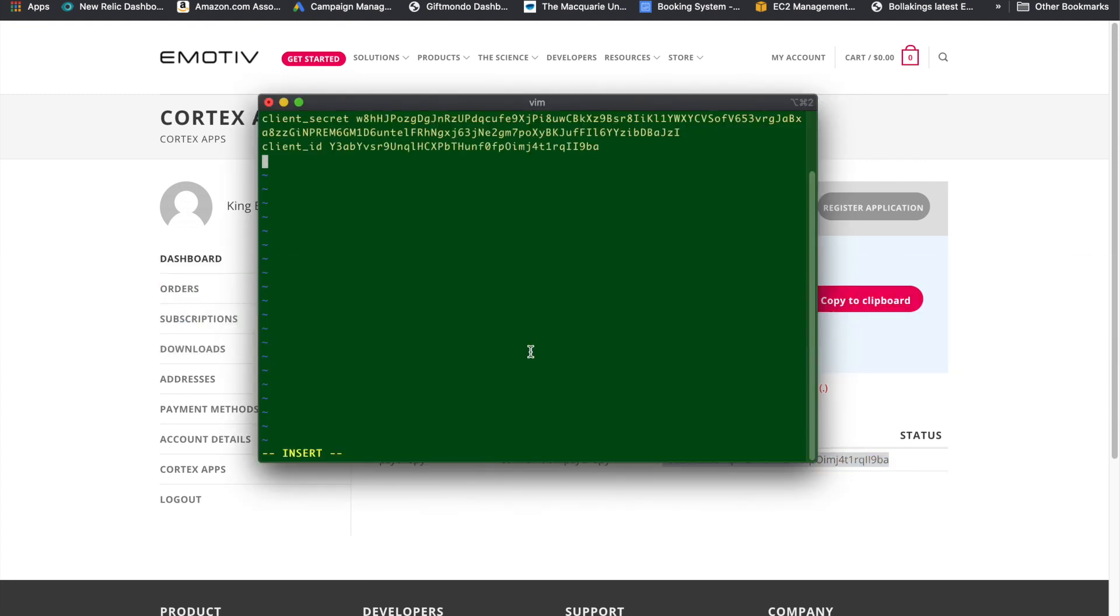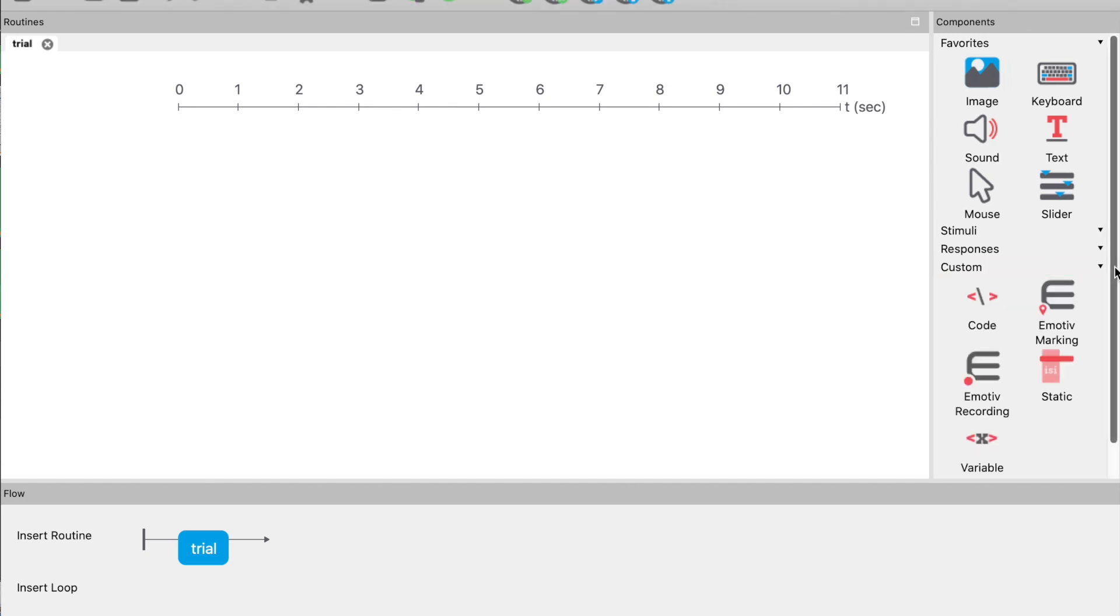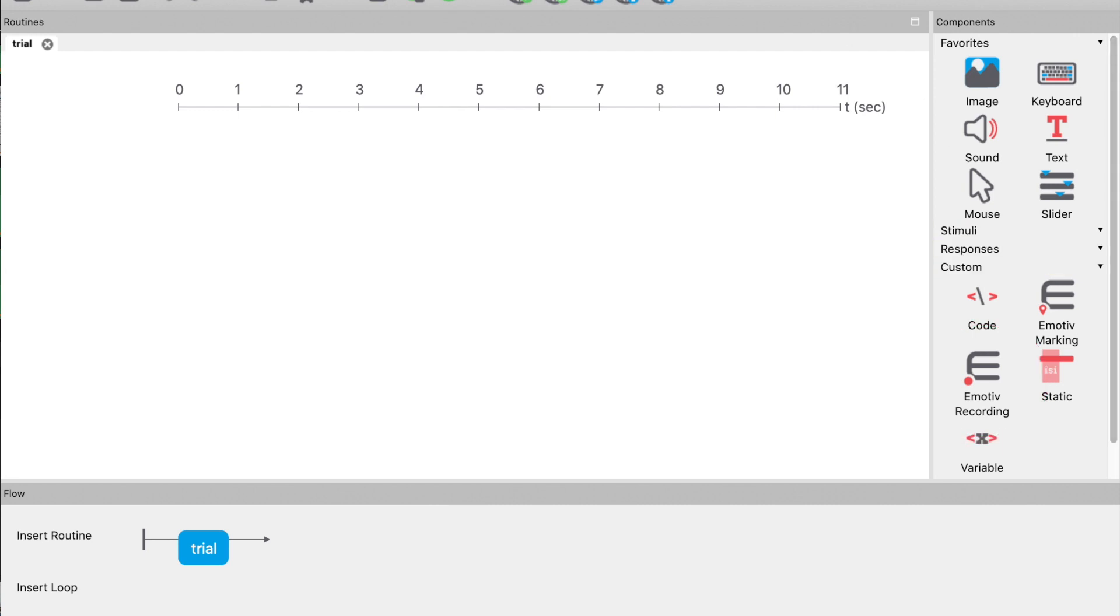There are two new components in PsychoPy that enable you to interact with EMOTIV hardware. They can be found in the custom components section. The first is the EMOTIV recording component, which allows PsychoPy to connect to the headset and start a recording. The other is the EMOTIV marking component, which allows you to accurately mark when events happen.